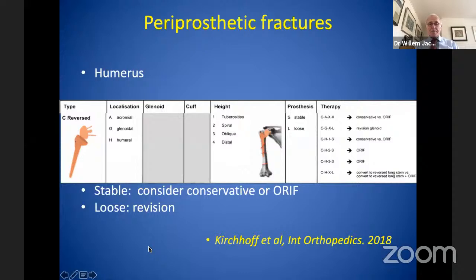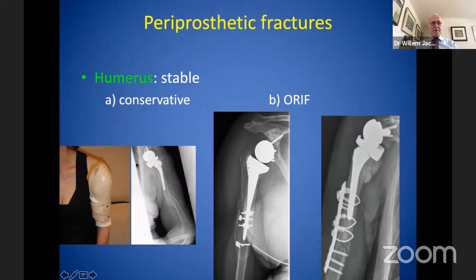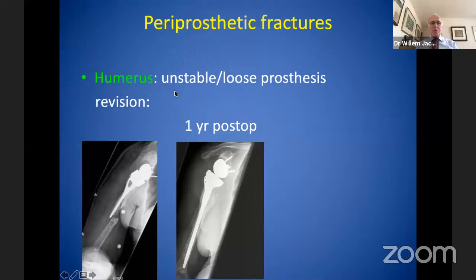The third pathology, periprosthetic fracture on the humeral side. I like this classification of Kirchhoff and the three areas where the fractures occur. Well, in a stable fracture, you can use conservative treatment. This patient refused treatment and healed well with malunion. Normally, I use ORIF, either cerclage or plate and cerclage. In unstable loose stem fractures, you have to revise. And here is an example of a revision with the 1 year follow up with a good result.